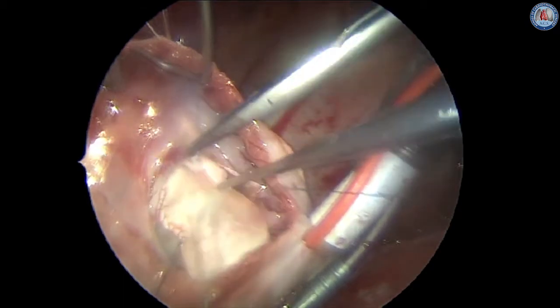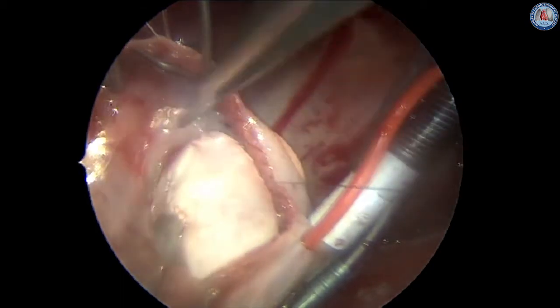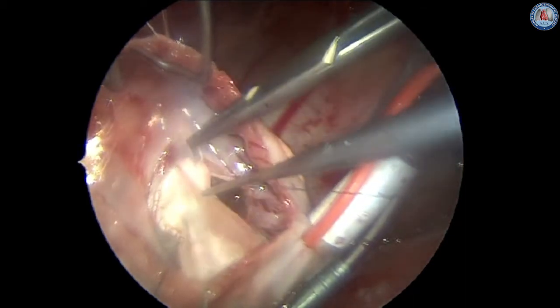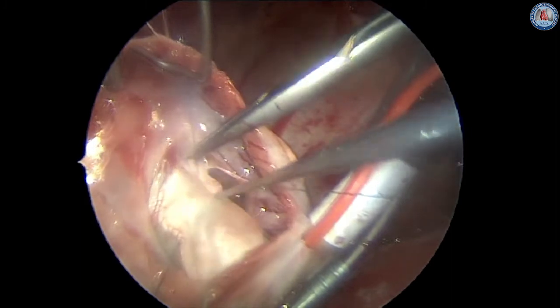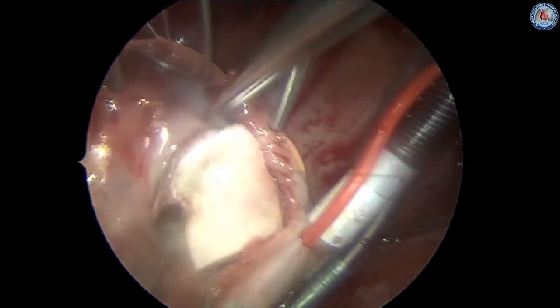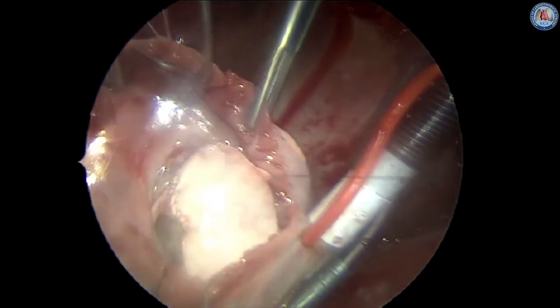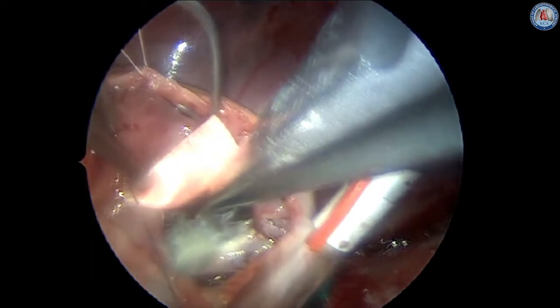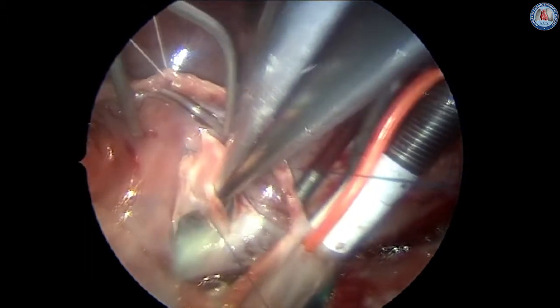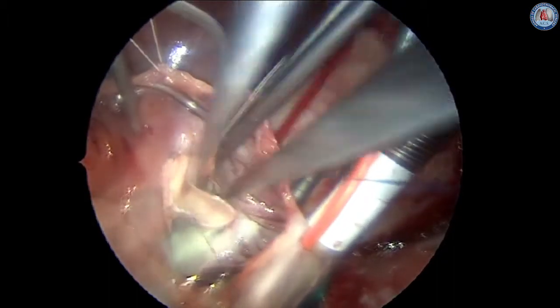Once the patch is prepared, the first half is sutured to the leaflet tissue with a running suture until the corresponding commissure, and then the second half is sutured in the same way until the opposite commissure. Once the patch is fixed, we start with the implantation of neocords for improvement of leaflet coaptation. We use the loop technique to facilitate neocord implantation.